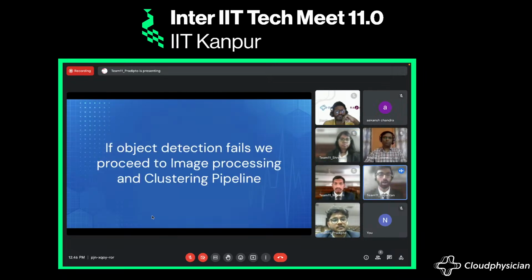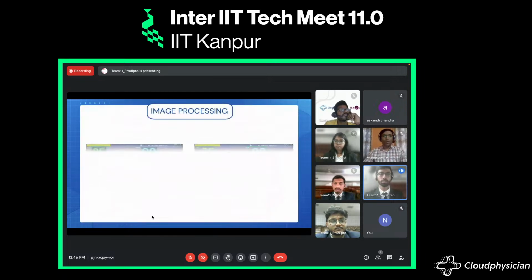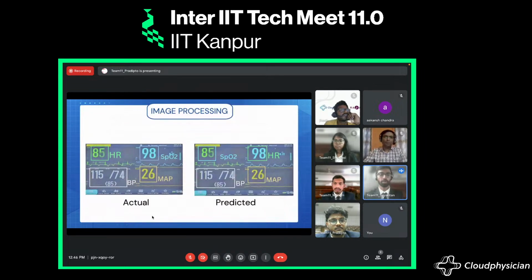In a few cases, our object detection model detects bounding boxes correctly. However, it labels them wrongly. For a particular label, when the bounding box has low confidence, for example, less than 80%, we try to find the label using the image processing plus clustering framework. As you can see here, HR is misclassified as SpO2. We have tried to solve this problem with an unsupervised clustering technique.